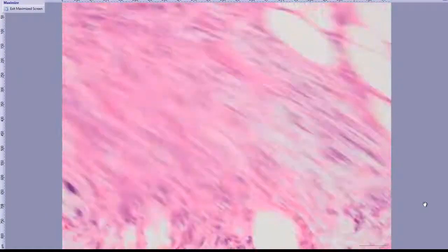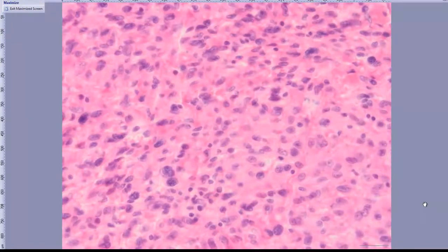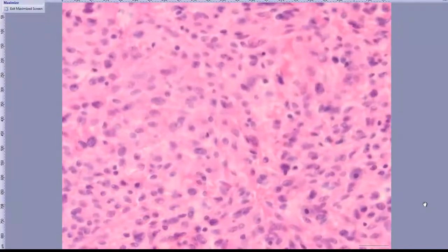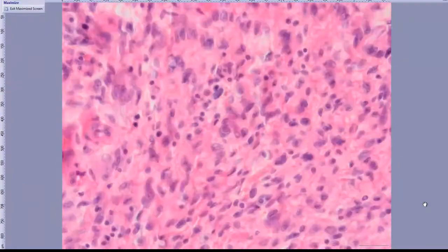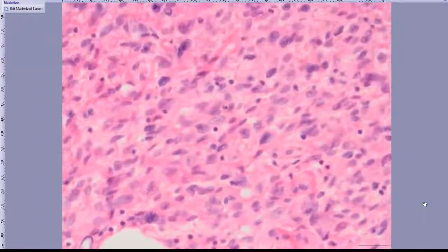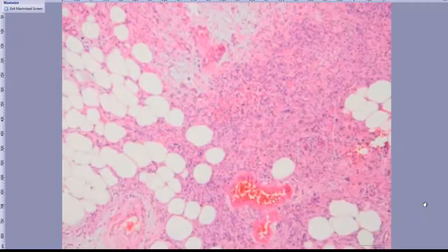And the other interesting feature of this tumor, here again another hypercellular part. Actually, the hyperchromatic ugly looking cells do not represent any virocyte or Reed-Sternberg like cell that might give a diagnosis of myxoinflammatory fibroblastic sarcoma or fibroblastic tumor.